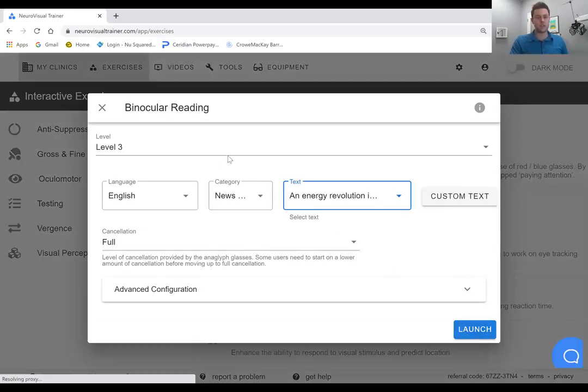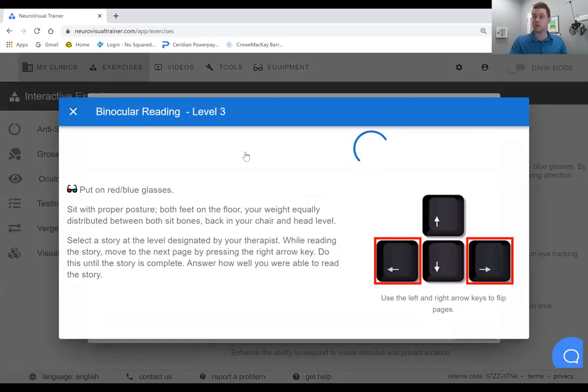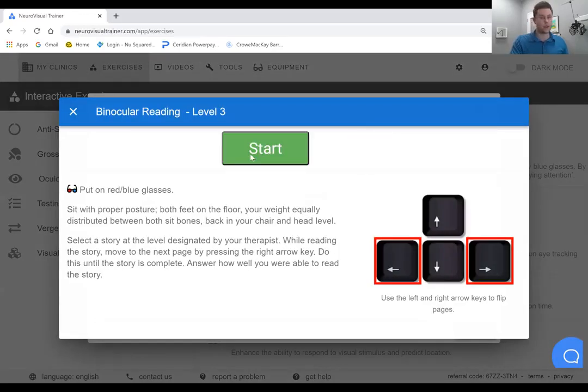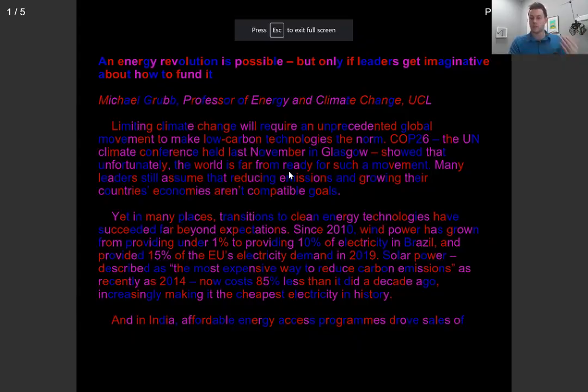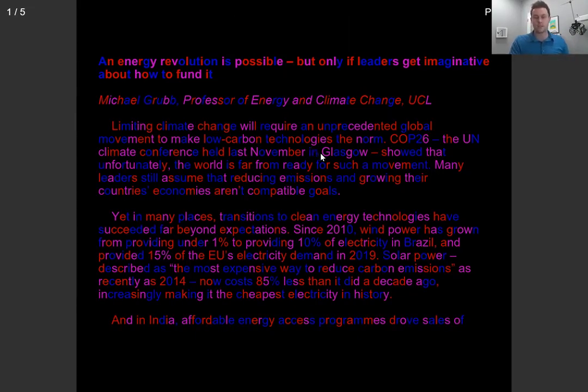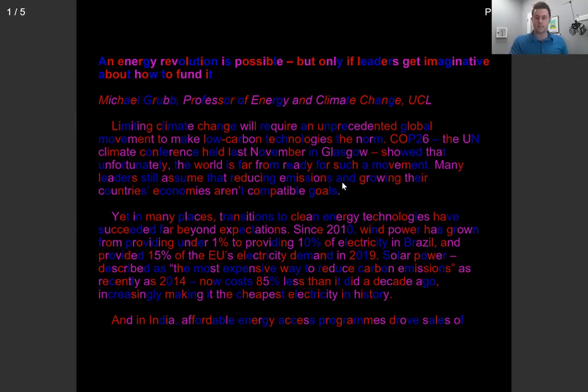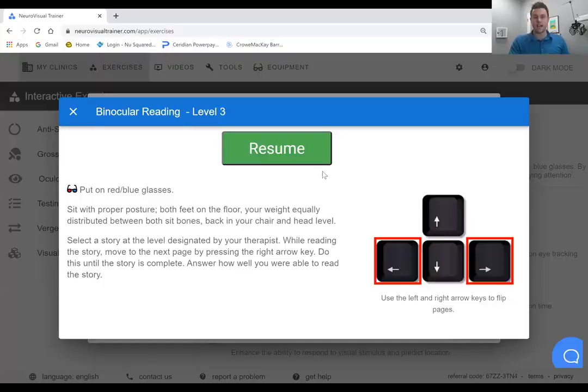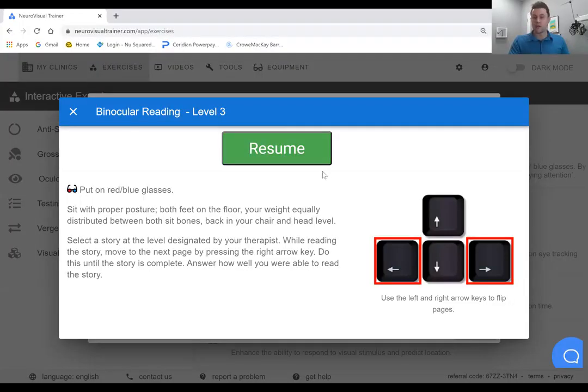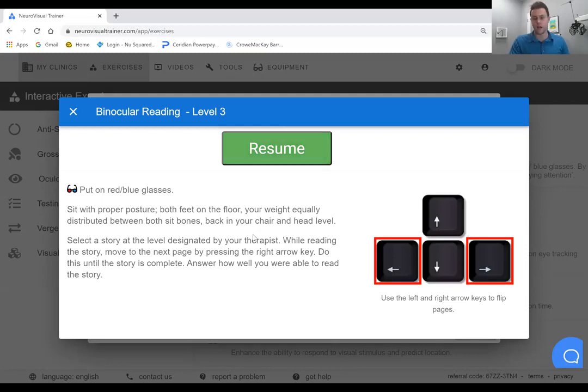When you launch, you put on the glasses that have been calibrated, either red green or red blue. You can see that the client can work through the reading of this particular text. Now there's no comprehension questions. But the fact that you can change and modify this material each and every day, we found to be far more valuable in the way of compliance.